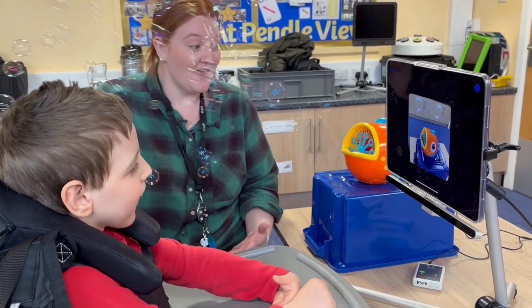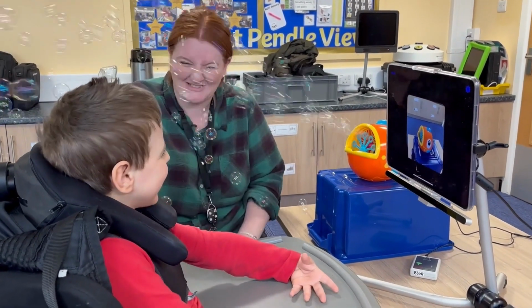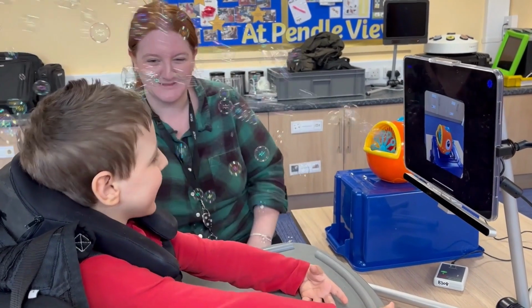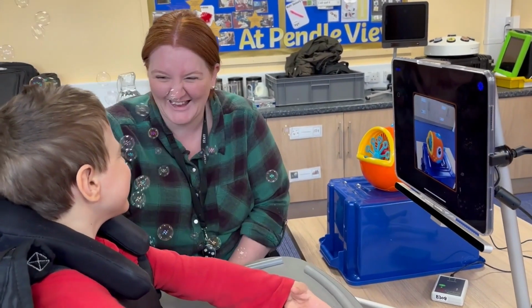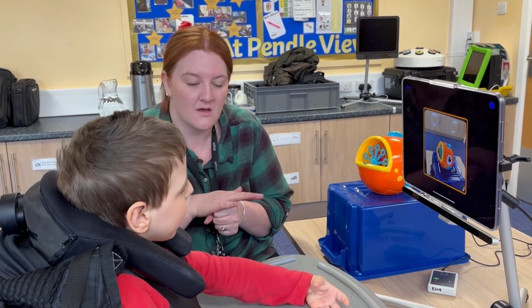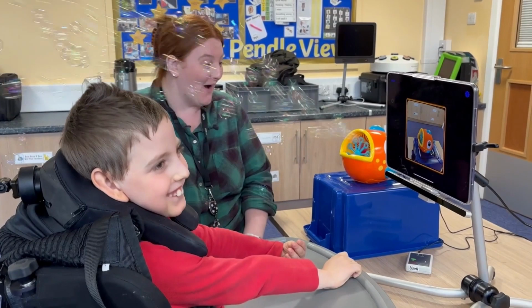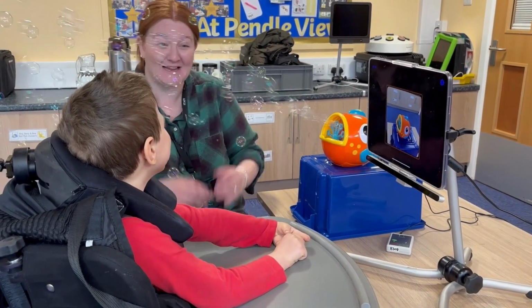For example, turning on the bubble machine and keeping it on until the whole room is filled with bubbles. Because he's really enjoying that. Too many bubbles. Wow, that is amazing. Oh, no. But you can see the great thing about this is not only does he know how to turn it on, but as you'll see in a second, how to turn it off.